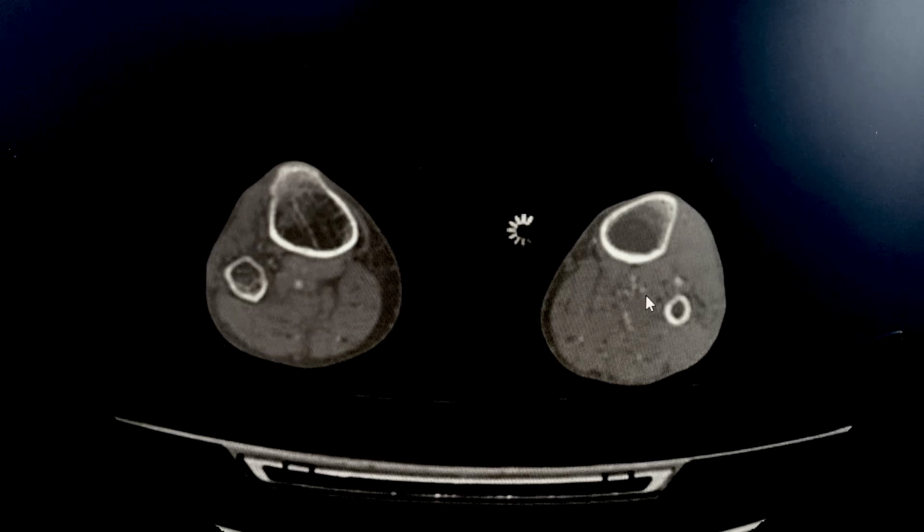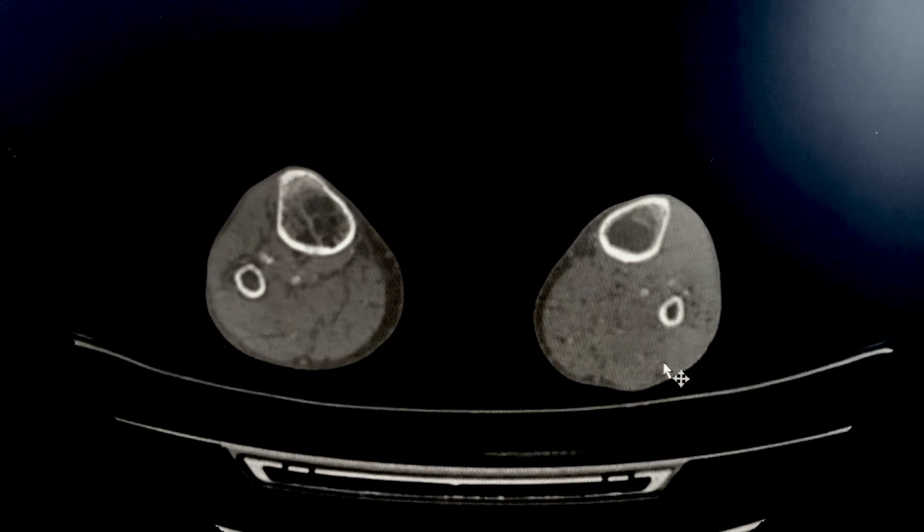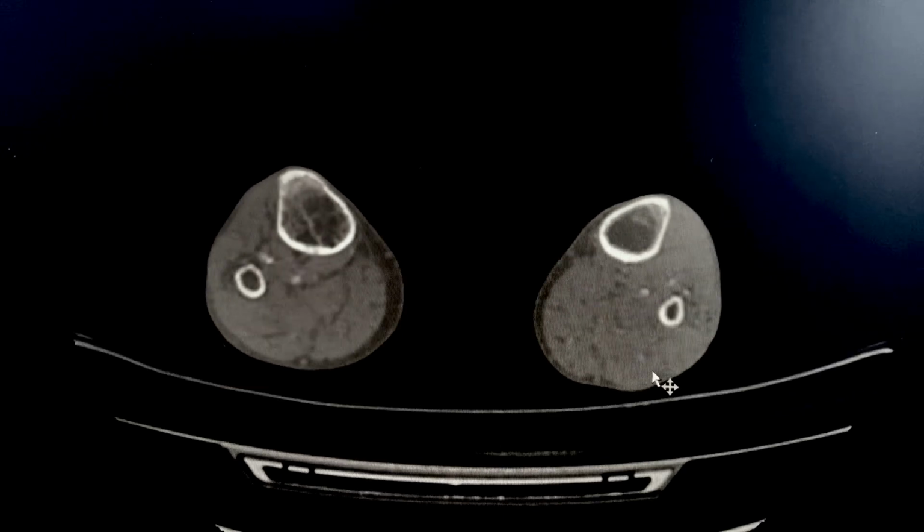but then going down here, you see the anterior and the peroneal arteries are both open, but then no sooner do you see the peroneal artery gives off here a collateral, because immediately below this collateral formation, you have occlusion, right? And this is the typical behavior of occlusive changes in the lower limbs, that prior to the occlusion, you always find that the artery gives off a collateral. The artery normally gives off a collateral, and sometimes 2 or 3 collaterals. I find it quite fascinating when I meet those changes.